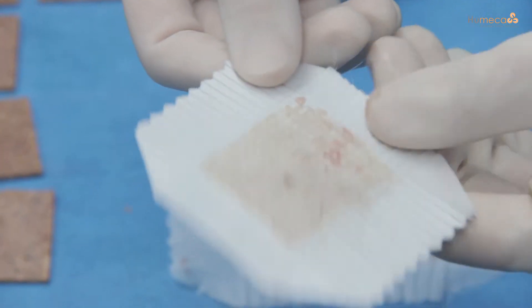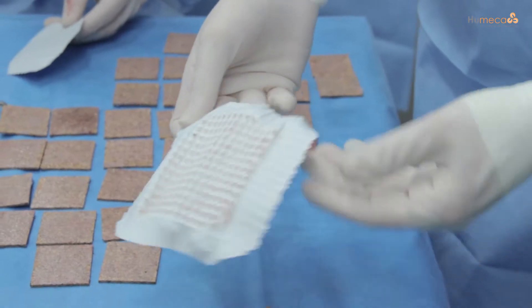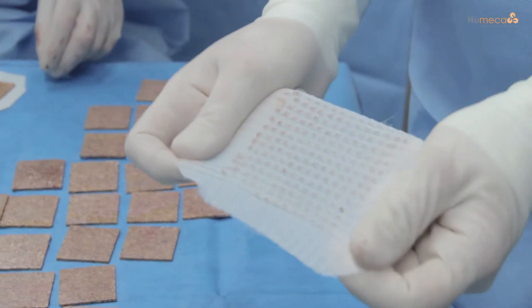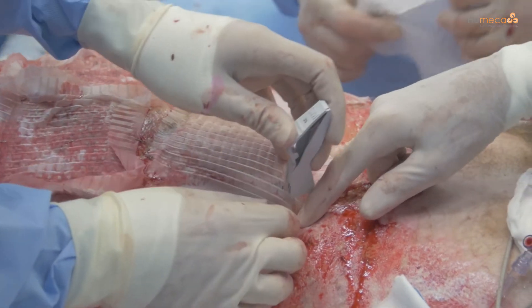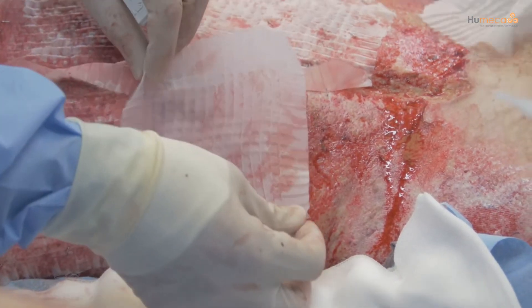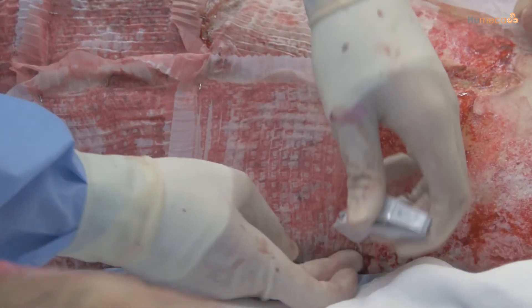Always start at the zigzag side for the first expansion and stretch completely. Then the second expansion on the plain side is to be done — stretch this completely as well. Remove the aluminium foil starting from one of the corners. A maximum of 196 skin islands is expanded in a controlled and fixed way. After the usual wound bed preparation, the gauzes are placed onto the wound bed and secured with staples, making sure that there is good, even contact. Apply the gauze graft side down to the wound bed. Stretch the gauze working corner to corner and flatten it to ensure optimal contact between the skin graft and the wound bed.